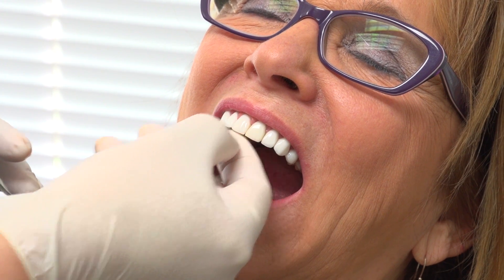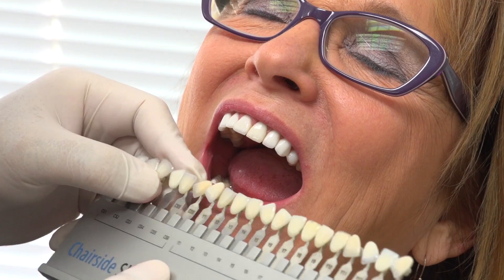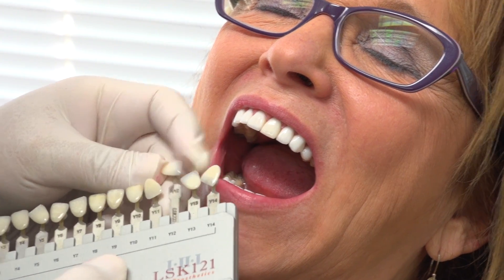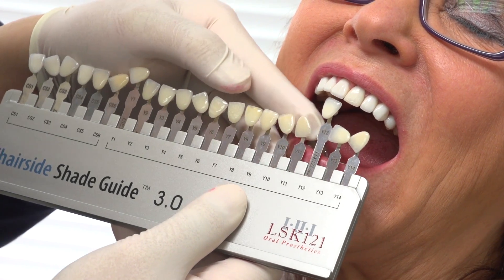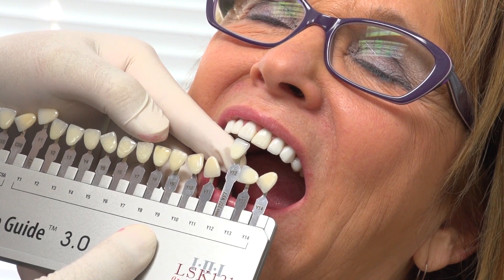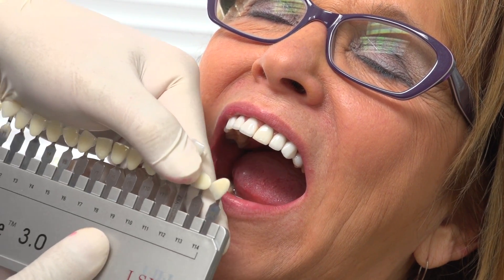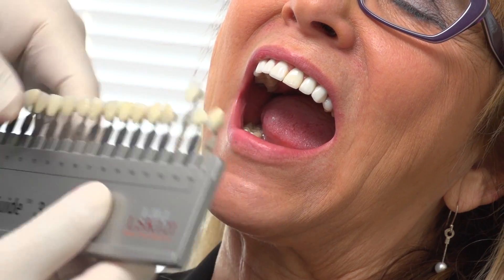I look at my shade tab at the 3.0 range, looking at the transparent color. Y12 is more close — so I can write it down: Y12, meaning that level of transparency color, which I will apply to that portion.